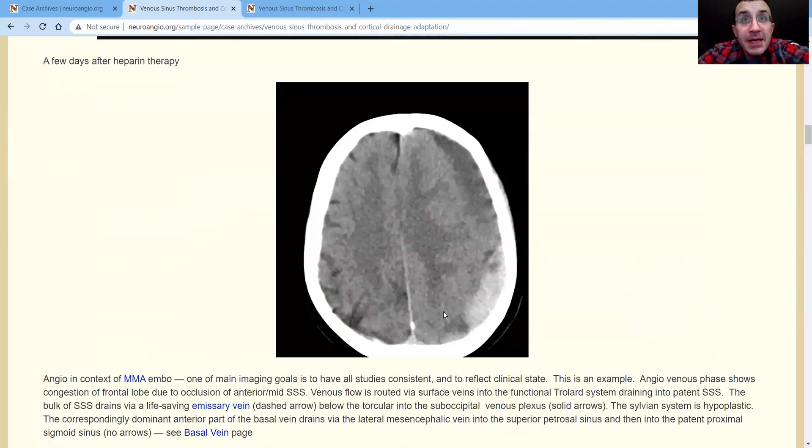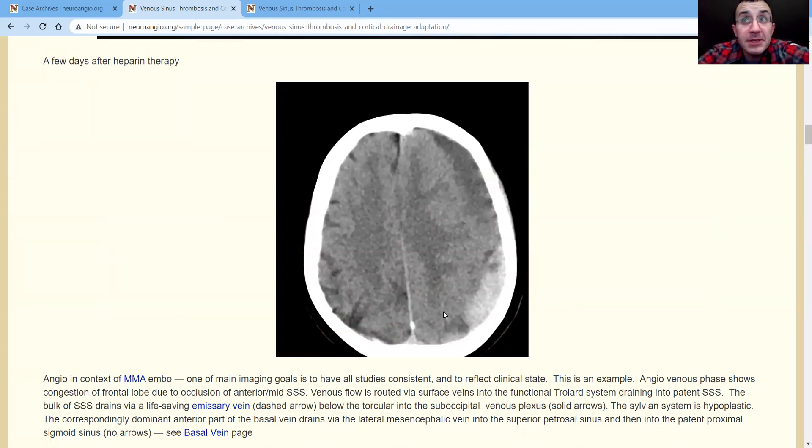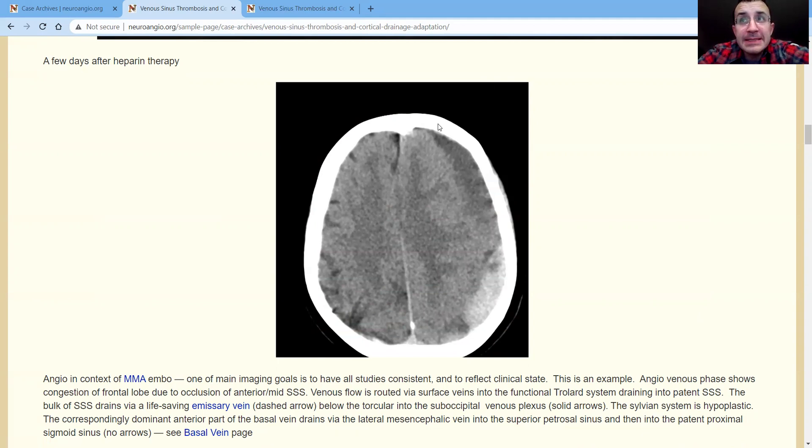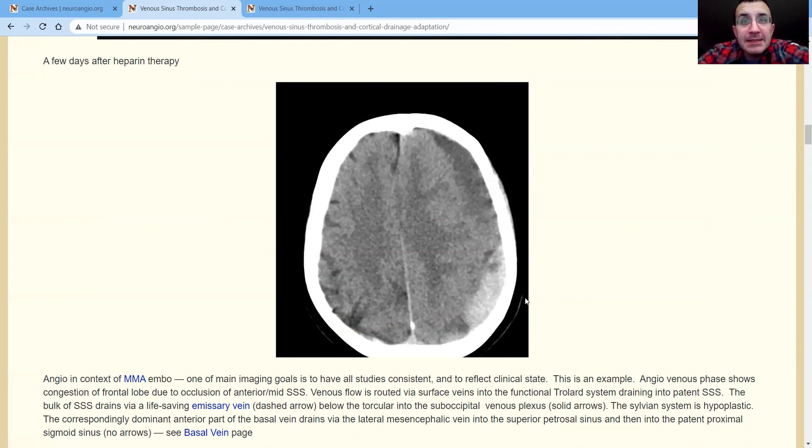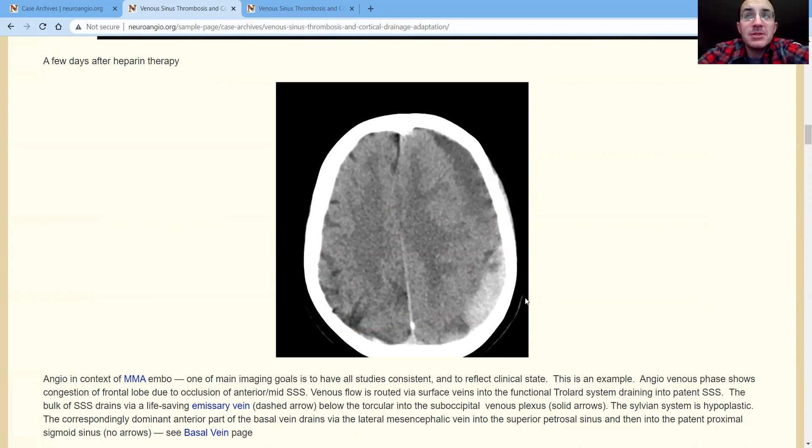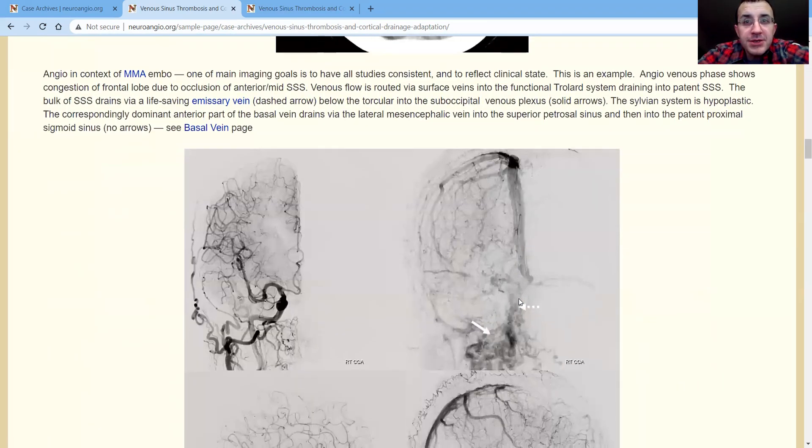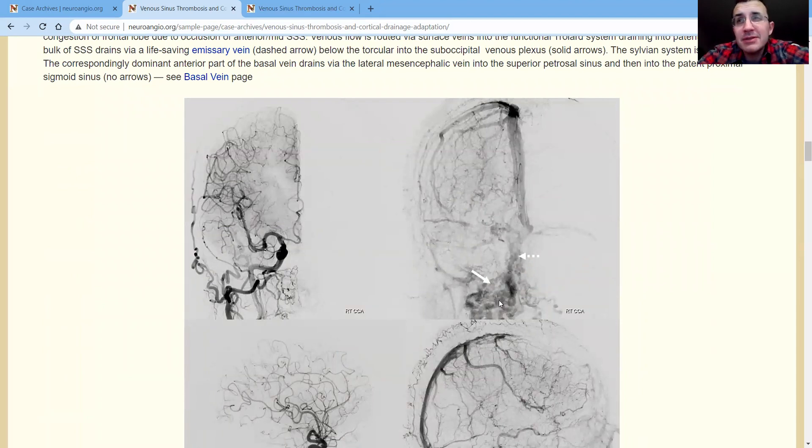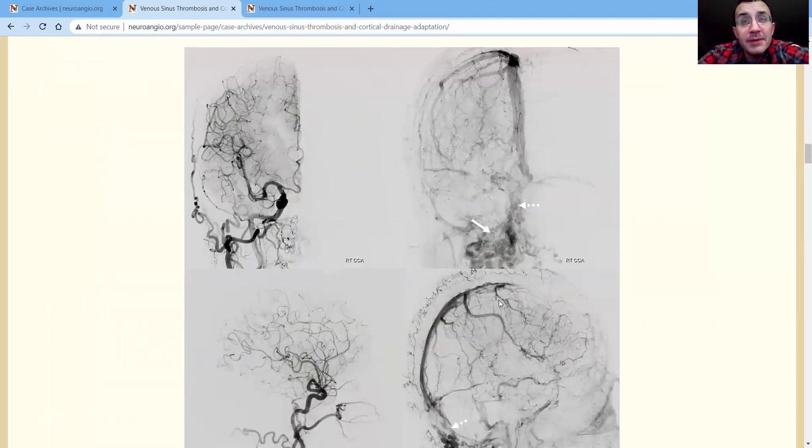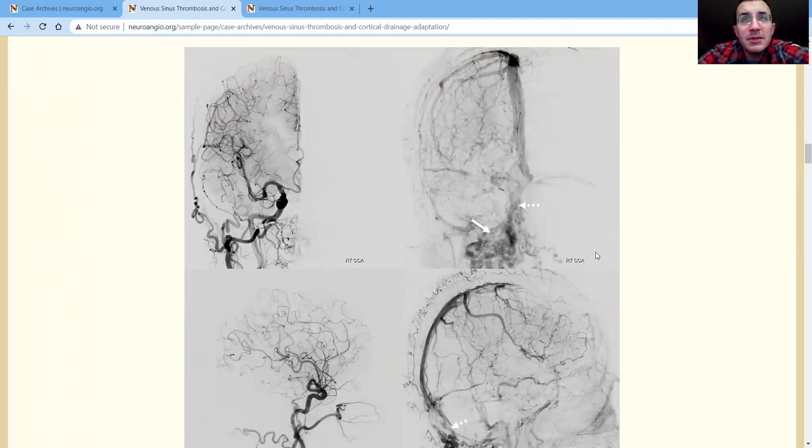And so this is what happens to her after some heparin therapy. As you can see, the subdural collections, there's now an acute huge component. So what happens is she gets drained of this and comes to us for an MMA embolization to top it off. So we get to do the angiogram as part of the MMA embolization. She's off heparin also. There's these different clinical considerations. She's doing well, again, from the clinical perspective.